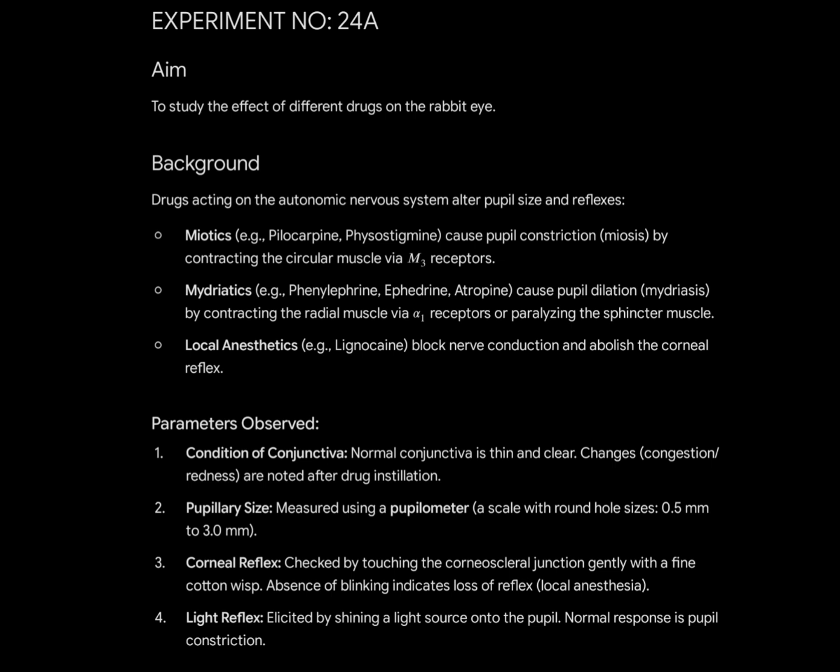Third is the corneal reflex, checked by touching the corneoscleral junction gently with a fine cotton wisp. Absence of blinking indicates loss of reflex, local anesthesia. Fourth is the light reflex, elicited by shining a light source onto the pupil. The normal response is pupil constriction.